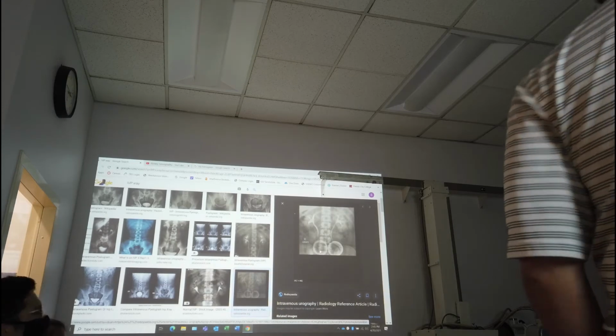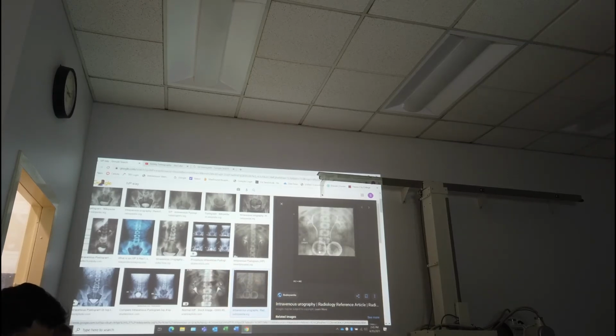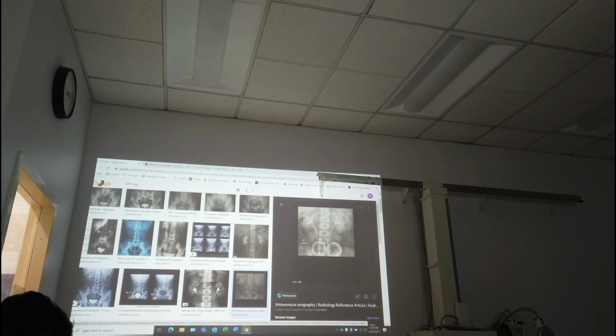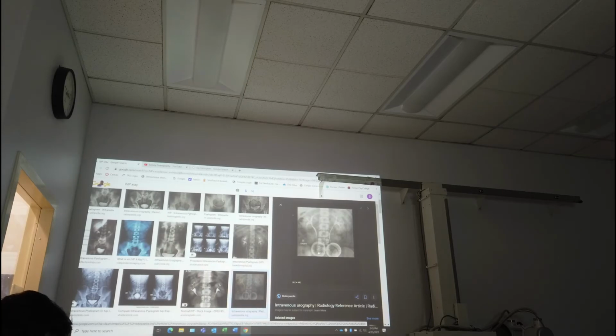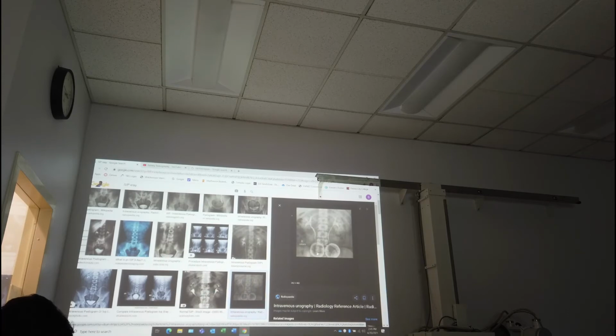And these are two little balloons, and each balloon has a little tube that connects to one of those blood pressure cuff things. You squeeze it, there's a little thing where you tighten it and you pump it in, and it's full of air. So what happens is they place them just on either side of the spine at the ASIS level, because that's where the ureters come down off the kidneys. And they'll place them there. They're not inflated yet. They're deflated.